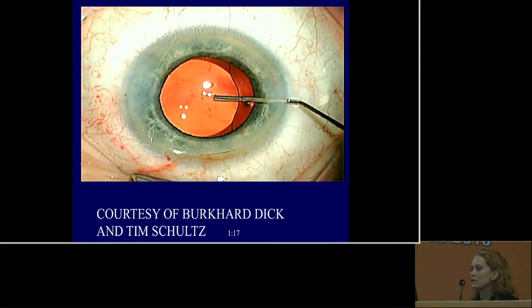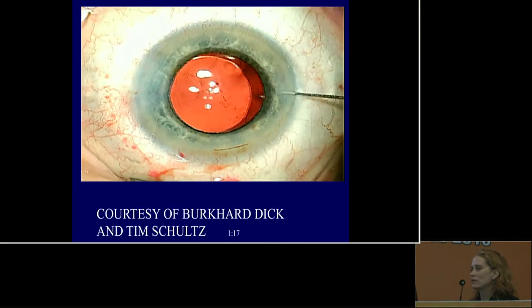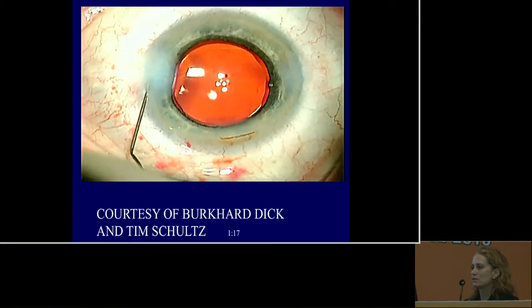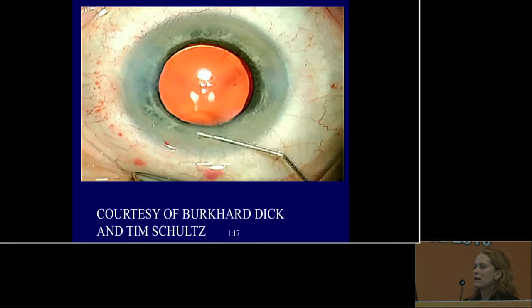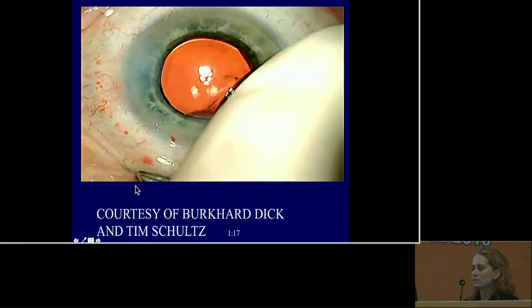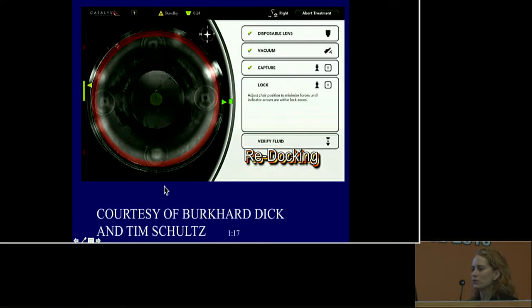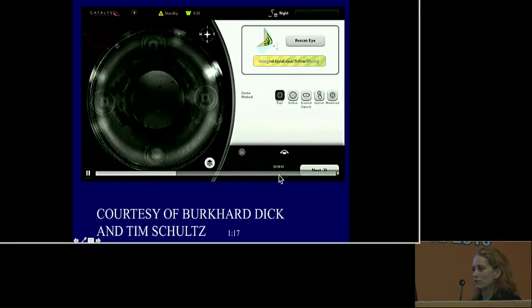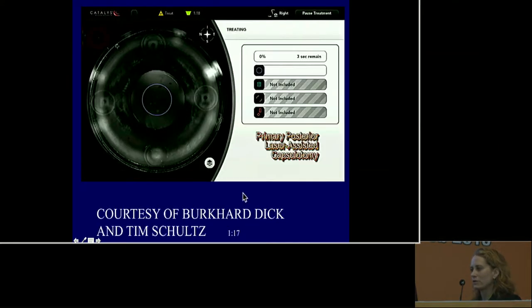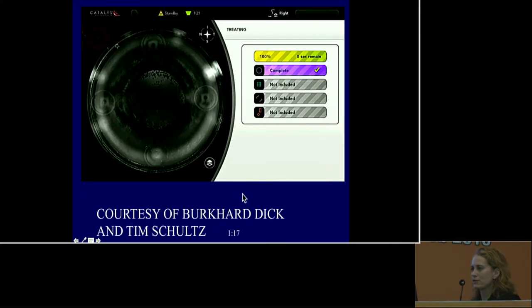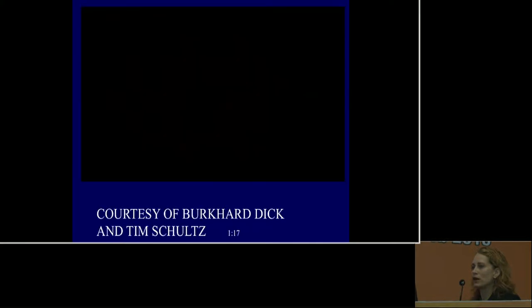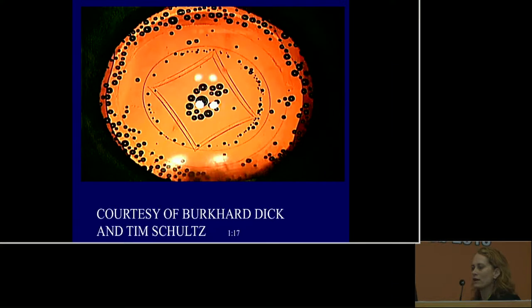The femtosecond technique involves putting OVD behind the IOL, ensuring all incisions are watertight, then re-docking the patient in the femtosecond laser — in this case the Catalyst — performing steps that fool the laser into thinking the posterior capsule is actually the anterior capsule. All the edges of the posterior capsulotomy roll up, move away, and somehow move out of the visual axis.